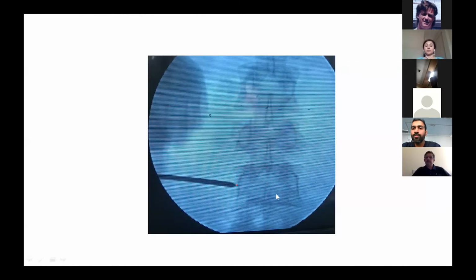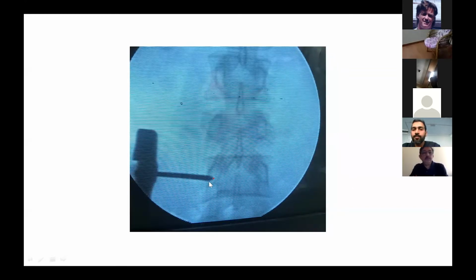We have to start at the A point, which is the lateral end of the pedicle. Under the image intensifier guide, we start through this point and place the trocar here. We insert up to point B and stop here. Then we have to see the lateral view. If on AP view we are at point B and on the lateral view our trocar is beyond the pedicle and into the body, this means that we are fine.